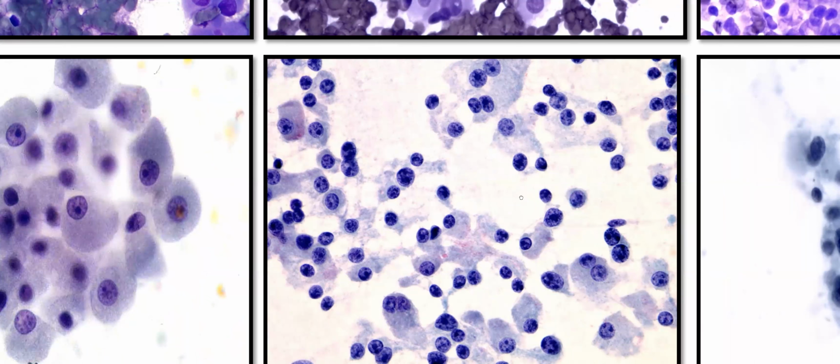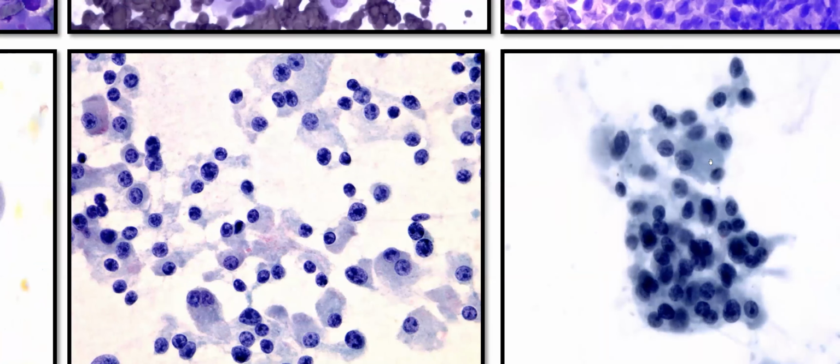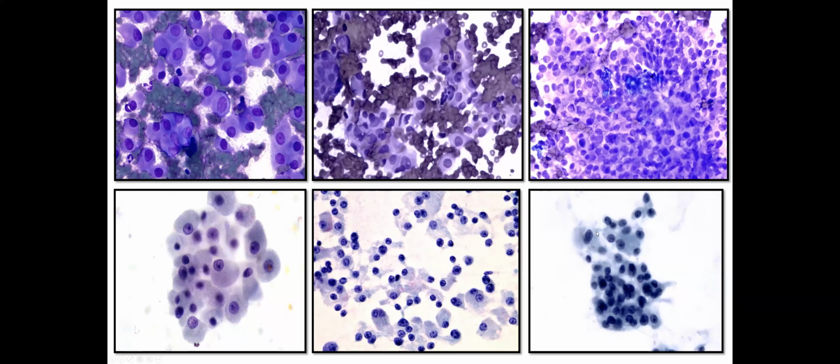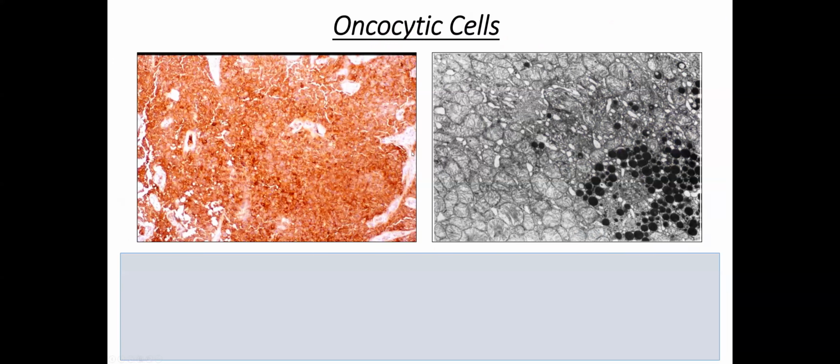On thin prep, they can maintain the same cytology, but they can also appear very dark. So one has to be careful when you're looking at the thin prep and have to relearn yourself. When you do thyroglobulin on these cells, you do see that there is a lot of density to the thyroglobulin in the perinuclear area, like a dot-like staining pattern.